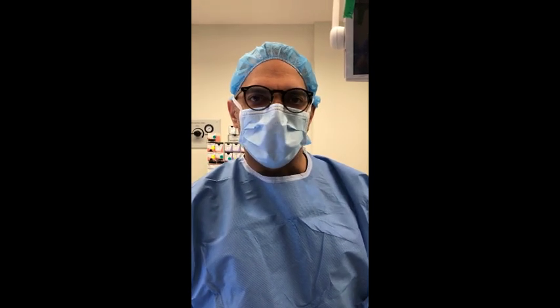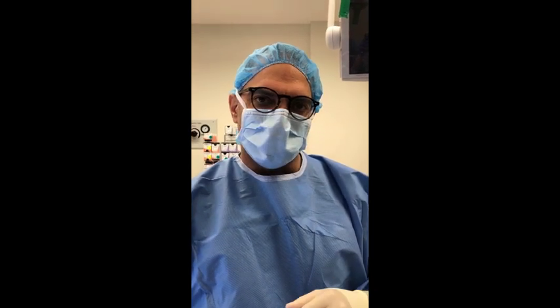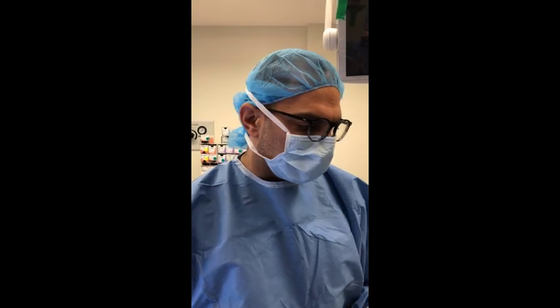Dr. Pinosian here from Los Angeles. We're doing a case of neurofibromatosis electrodesiccation. One of the things I wanted to show today is a newer technique that I'm doing for the small bumps that occur around the mouth area and the laugh lines.